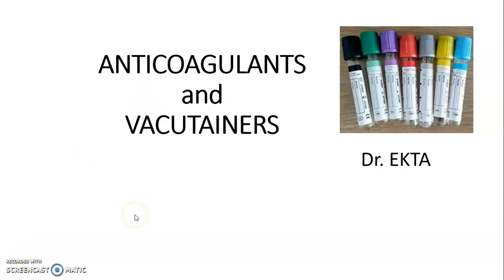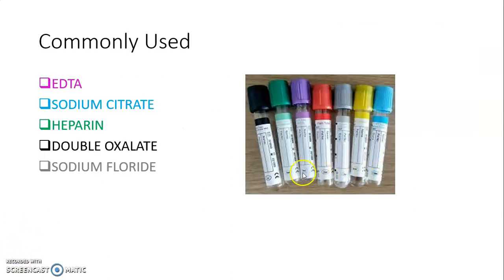Hello everyone. The topic for today's discussion is anticoagulants and vacutainers. These are the vacutainers or vials with different colored tops, and they contain different anticoagulants.